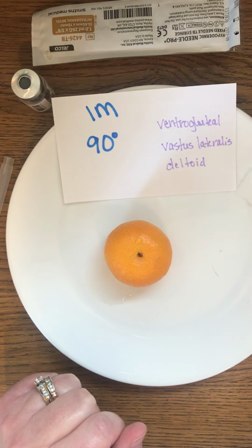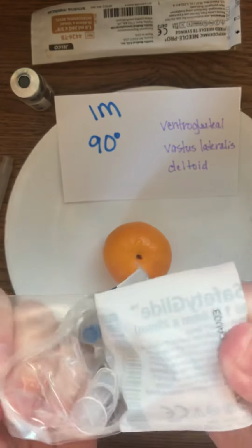So again, you'll notice here the syringe I have. It is a 23 gauge, so you're going to see it's going to be a larger size needle. And this particular one I have is just a 1 inch. So again, you can see all the way up to 3 inches, which is really quite large when you have a needle coming at you.